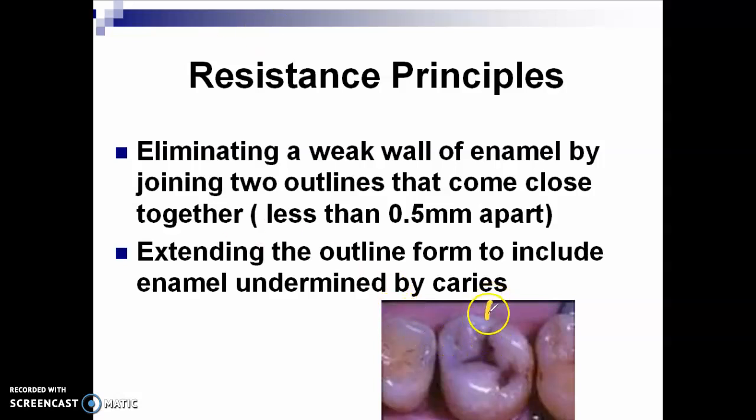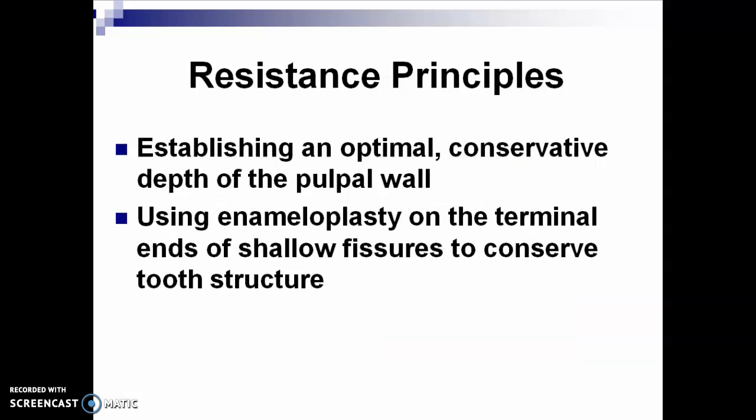For example, in this molar, the caries extends very near to the distal pit area, so this oblique ridge will have to be crossed during the preparation. Otherwise, you will leave a thin enamel in that oblique ridge. Establish an optimal conservative depth of the pulpal wall. Use enameloplasty on the terminal ends of shallow fissures to conserve tooth structure.